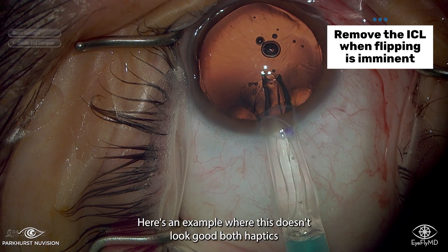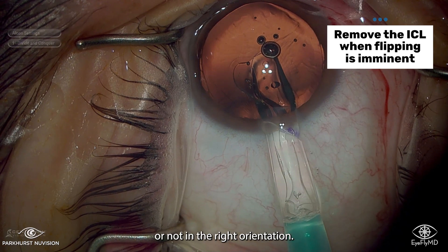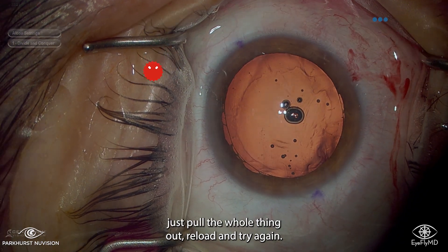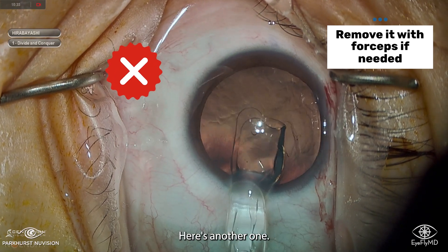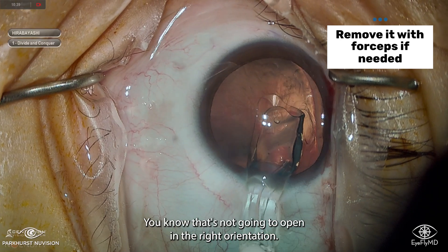There are times when, to avoid a flip, it's better just to stop and reload. Here's an example where this doesn't look good — both haptics are not in the right orientation. You can see how much the injector is rotated and that's not working, so just pull the whole thing out and try again. You can't always pull it out using the injector.